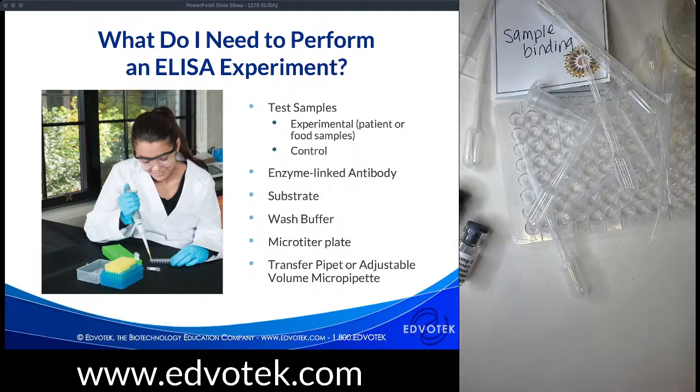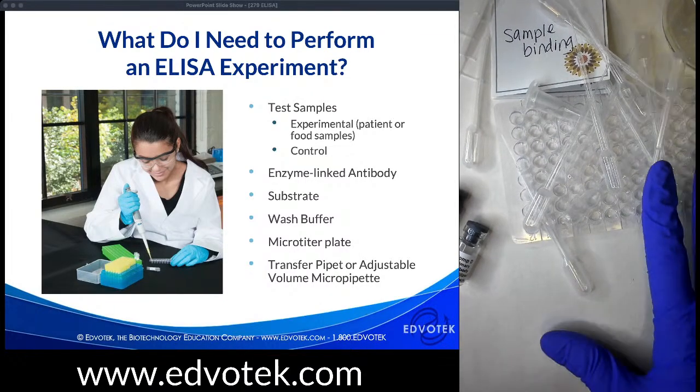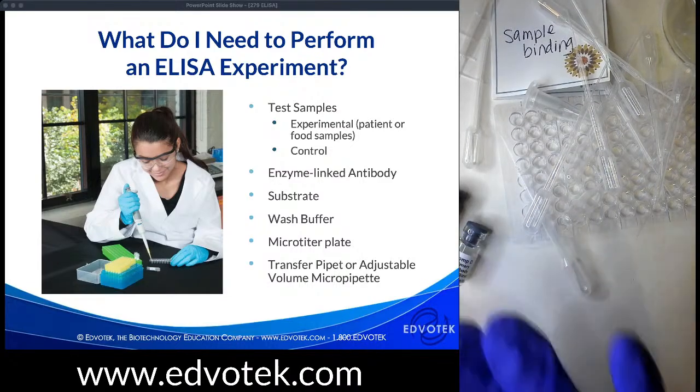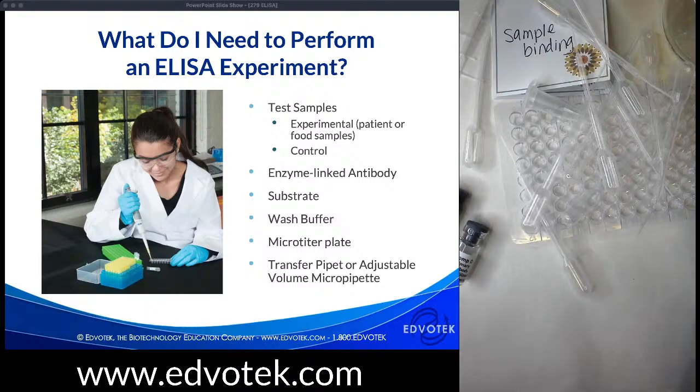Next, we're going to have two samples. We're going to have our experimental samples, and we're going to have our control samples. Our controls for our medical tests are going to allow us to know whether our experiment is working right. A positive control will give a positive result, and a negative control a negative result. If our controls fail, or if our assay does not give the correct results, it does represent a learning moment, in that we can have our students analyze and explain what went wrong as carefully as what went right.